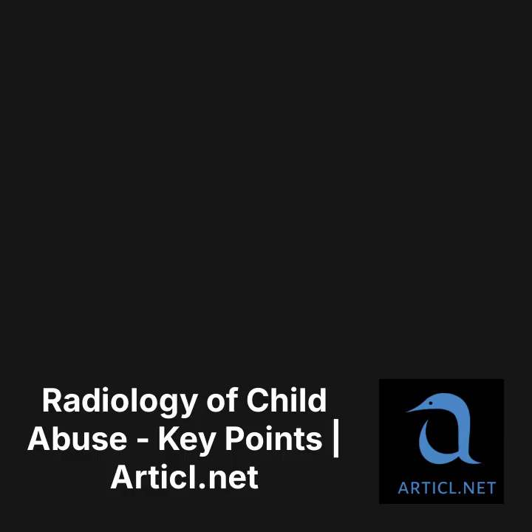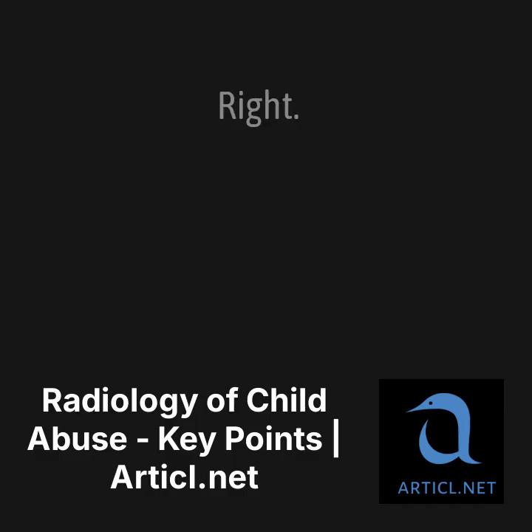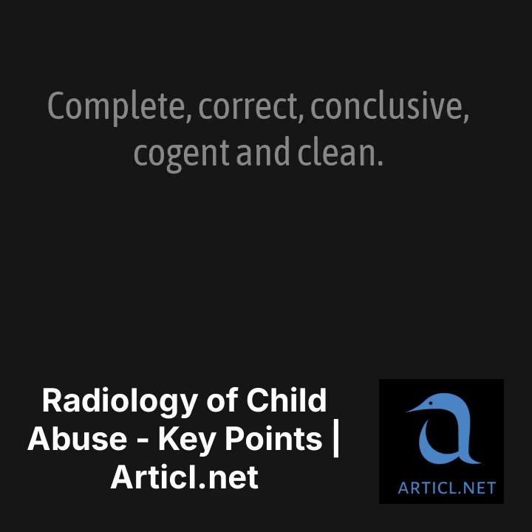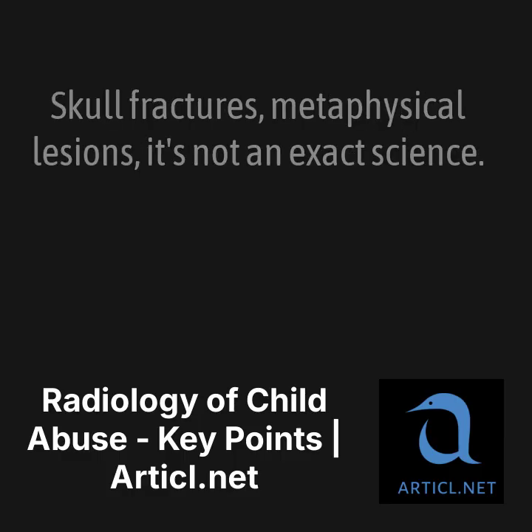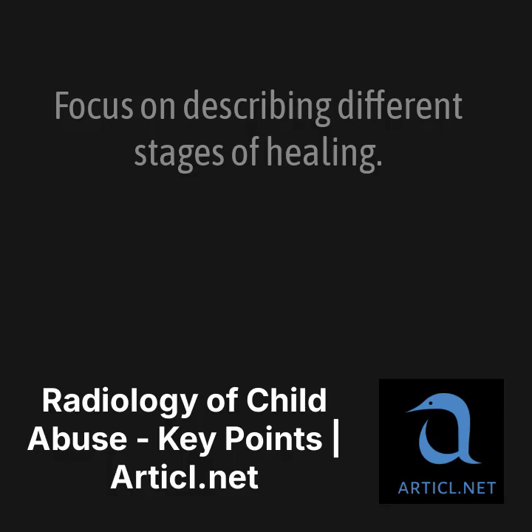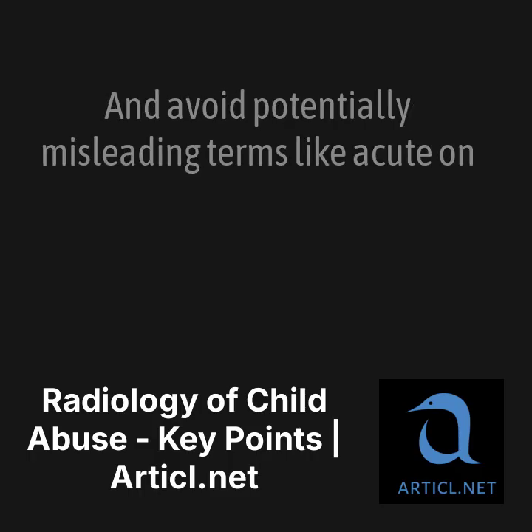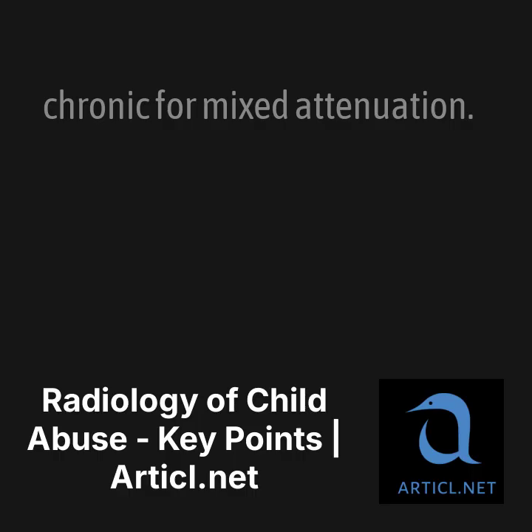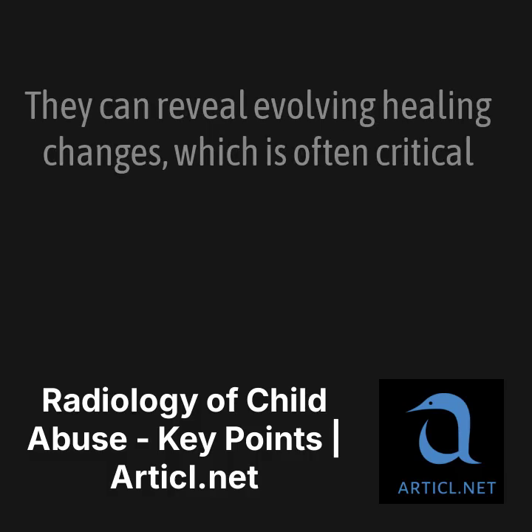Okay, last big piece, the report. Given the huge medico-legal weight, how do we make sure our reports are absolutely solid? Right, the 5 C's are essential: complete, correct, conclusive, cogent, and clean. We need to be cautious with dating injuries, though. Skull fractures, metaphyseal lesions, it's not an exact science. So instead of pinning down exact dates, focus on describing different stages of healing. That suggests multiple events over time. And avoid potentially misleading terms like acute on chronic for mixed attenuation subdural hemorrhages. Makes sense. And follow-up skeletal surveys. Vital. Standardized 10 to 14-day follow-ups. They can reveal evolving healing changes, which is often critical evidence.